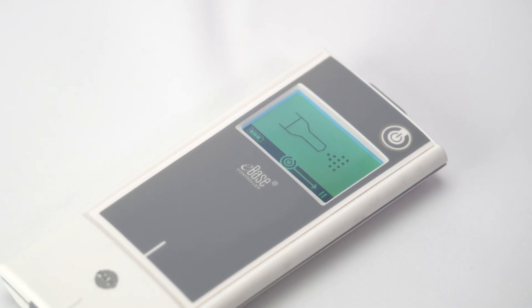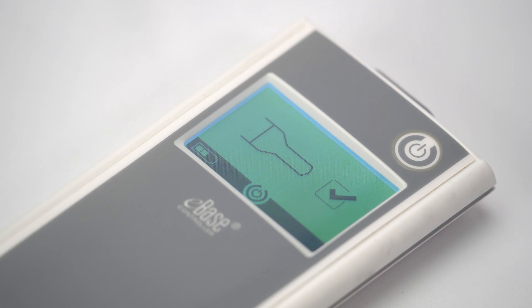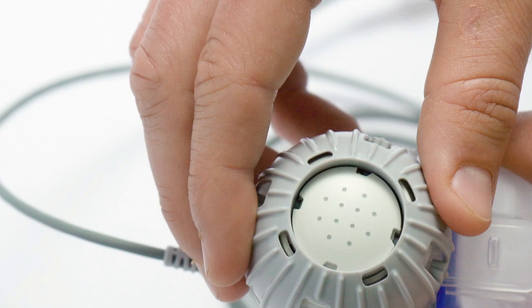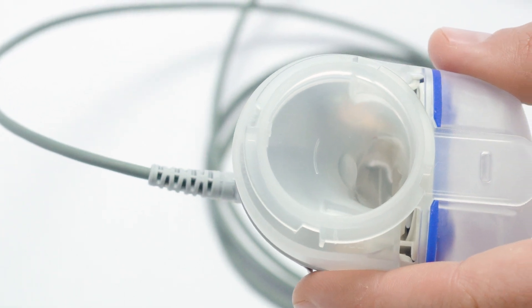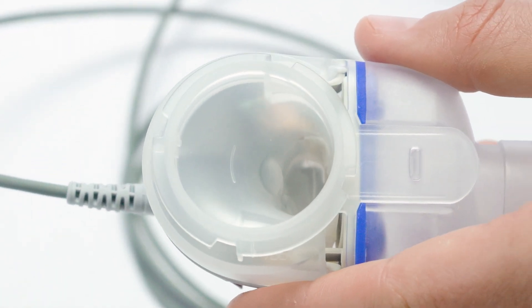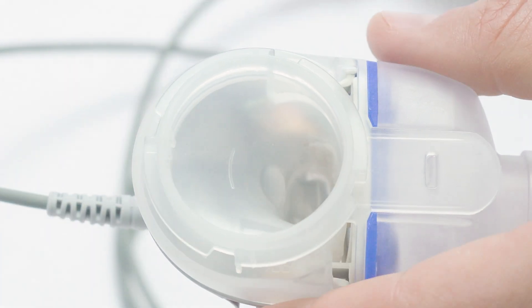The nebulizer system has a pause mode. To pause your treatment, press the on-off button if needed. Press the same button again to resume the inhalation session. At the end of treatment, the controller will shut off. You will hear two beeps and a tick will appear on the screen briefly to indicate that the treatment is complete. For the eFlow Rapid Nebulizer handset, about one milliliter of medication remains unused in the medication reservoir. This is intentional and does not represent a malfunction.